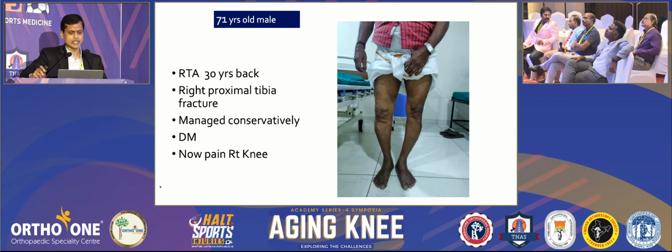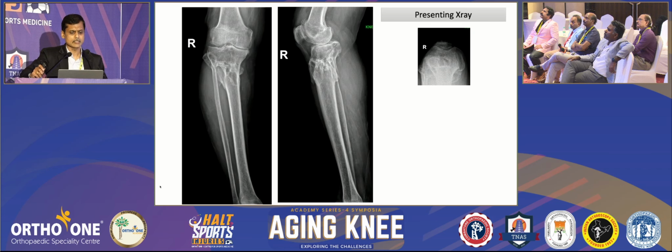Okay, 30 years back, this patient had an RTA, had a proximal tibia fracture, managed conservatively. Diabetes mellitus, but all under control. Now pain in the right knee, and this is an X-ray. Karthik?